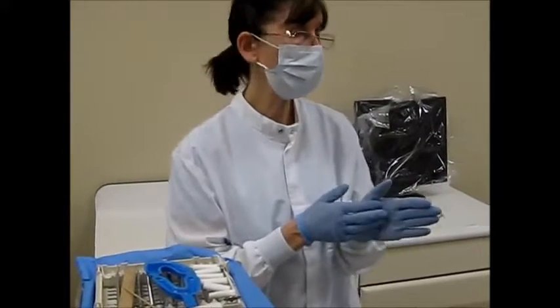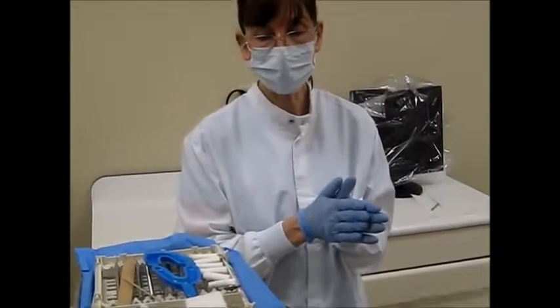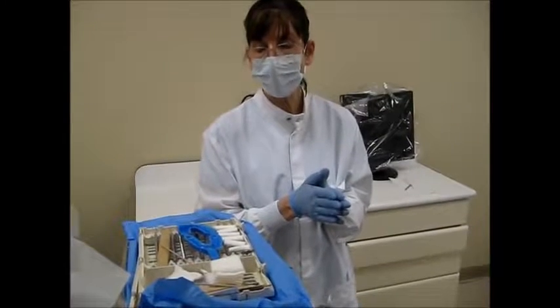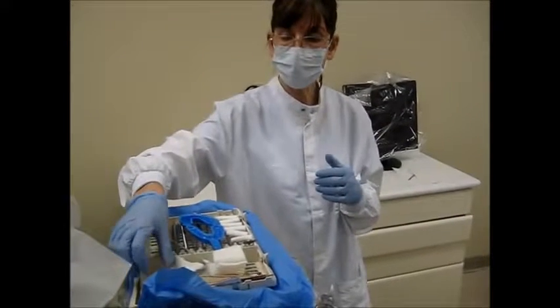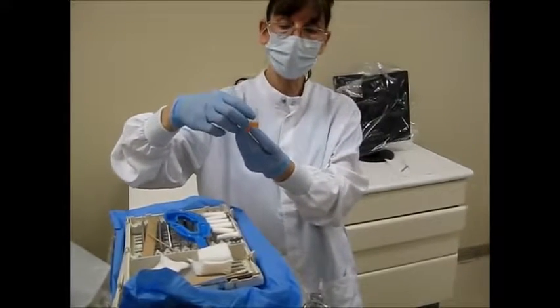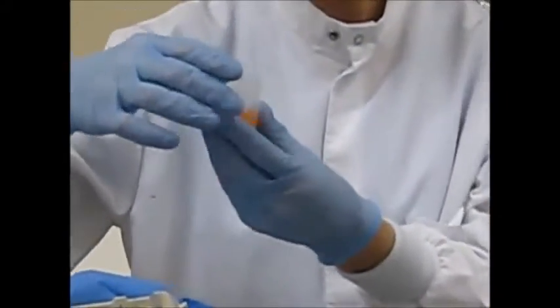This particular patient presents with some tooth-colored sealants. Therefore, I want to use the neutral sodium fluoride, and I have obtained 5 milliliters of the neutral sodium fluoride. And as you take a look at the medicine cup, you will see the 5 milliliter mark on that cup.